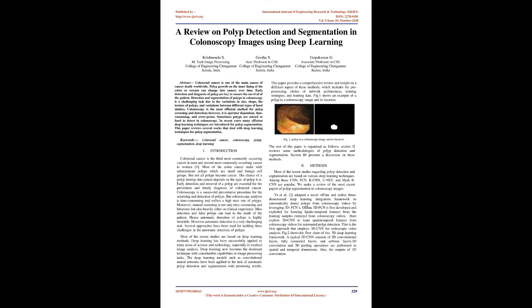A review on polyp detection and segmentation in colonoscopy images using deep learning. Abstract: colorectal cancer is one of the main causes of cancer death worldwide. Polyp growth on the inner lining of the colon or rectum can change into cancer over time. Early detection and diagnosis of polyps are key to ensure the survival of the patient.